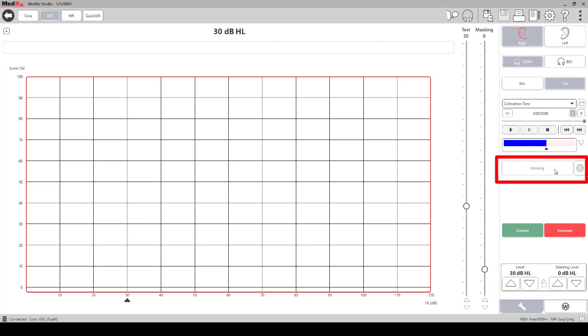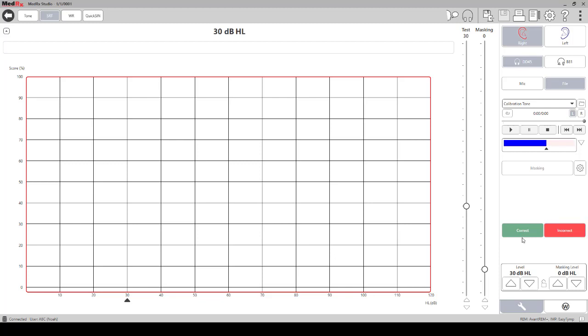Just below, you will find your masking bar and masking options. Then you'll find the correct and incorrect icons, which are used to score speech testing with the mouse. You can click on the correct and incorrect icons to score while the files or CD are running continuously.